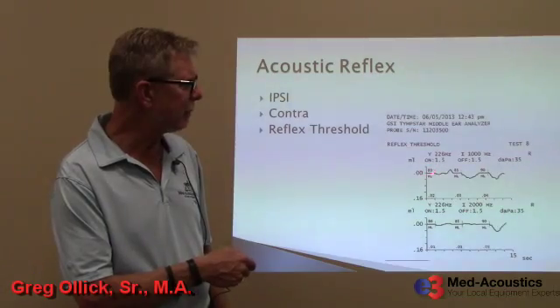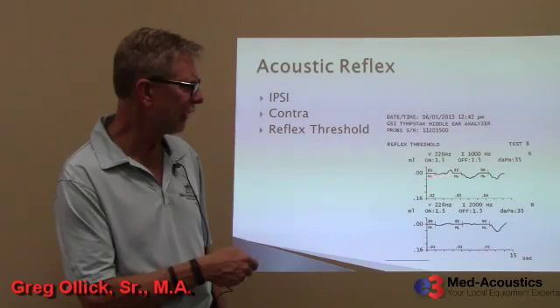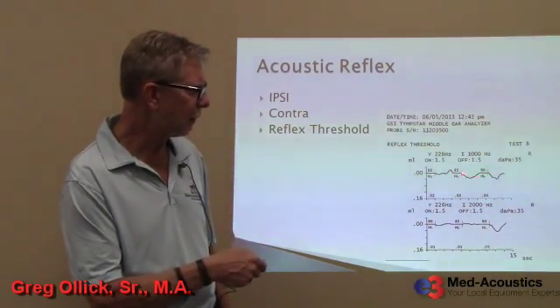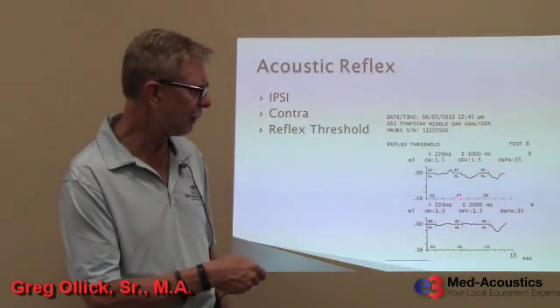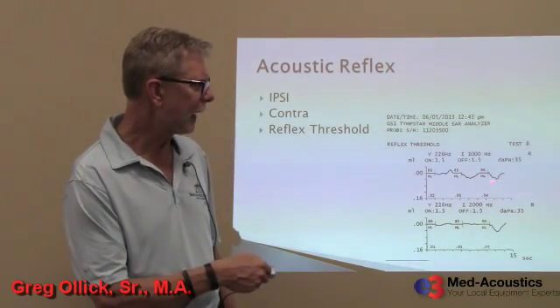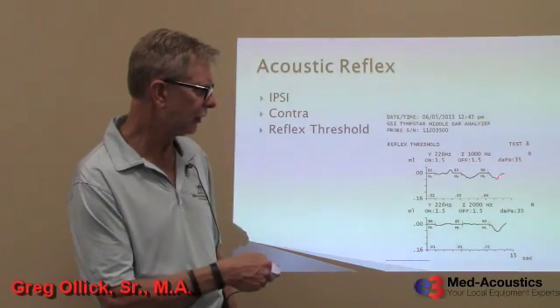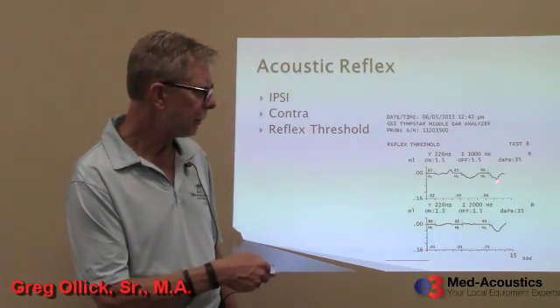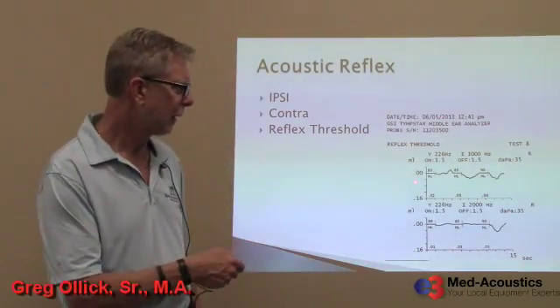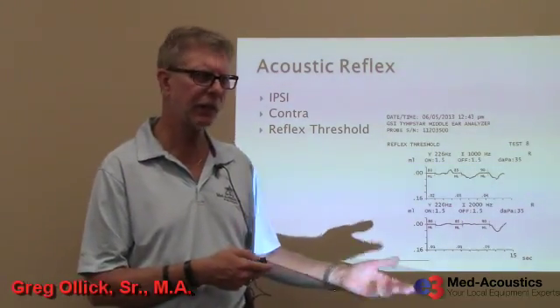All right, so at 80 dB, there was insufficient change for me to hang my hat on a reflex there. So we went to 85, and there was a clear change in compliance. This time it was 0.03. We went up higher to 90 dB, and we got a change in compliance also, with a very clear onset of the change, and then here is the offset of it. The amplitude of the change was 0.04, so that's growth of reflex: 0.02, 0.03, 0.04 as we increase the intensity of the stimulus.